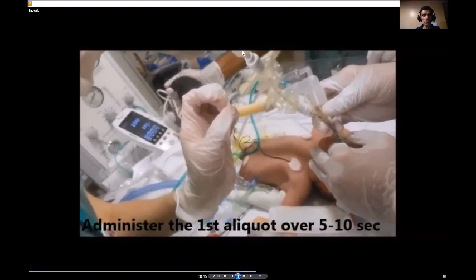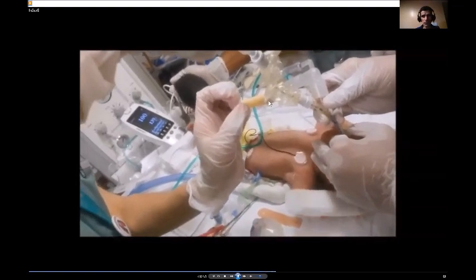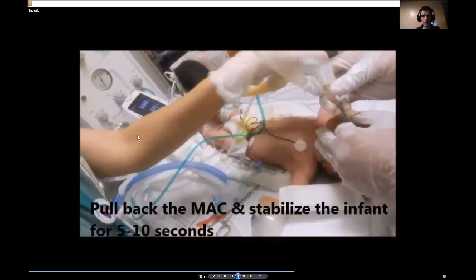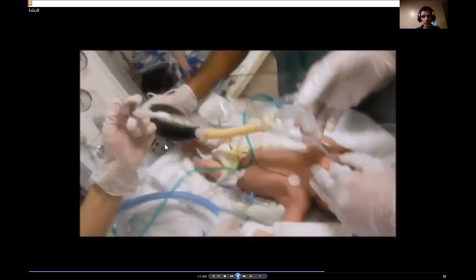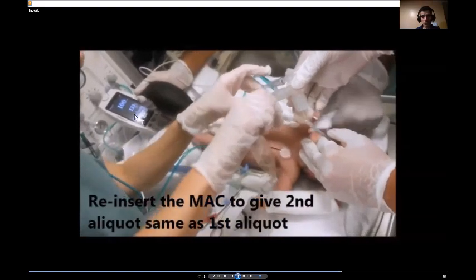You can see we connect the syringe to the MAC catheter, insert the MAC catheter inside, and then inject surfactant and pull it back. We like to give it in two aliquots to prevent incidence of hypoxemia, always monitoring oxygen saturation and heart rate.